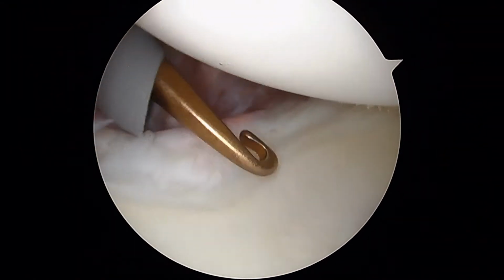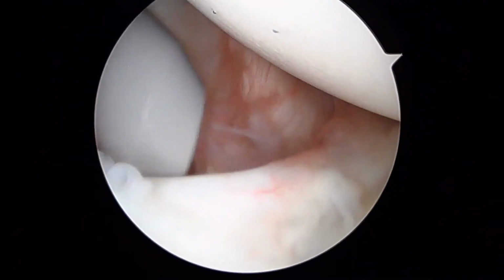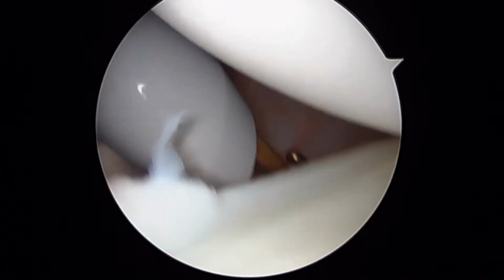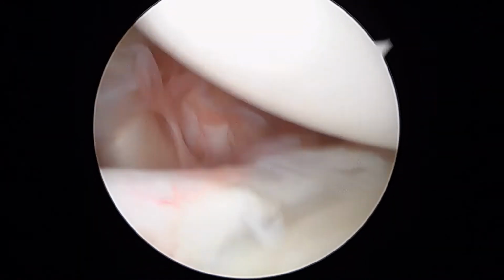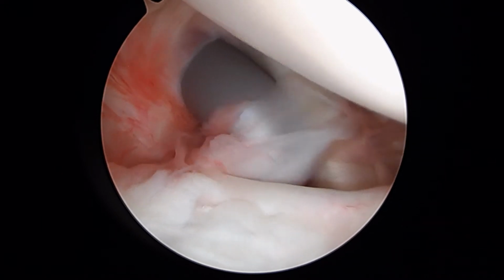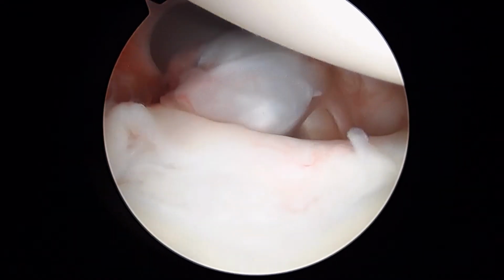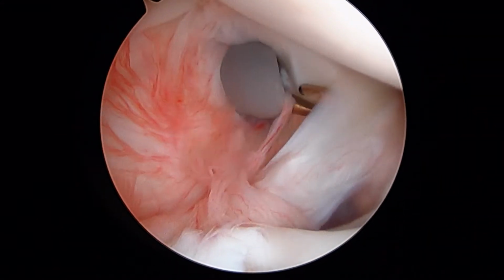And then as we look down the front of the shoulder, the anterior ligaments look just great. Here's the anterior band of the inferior glenohumeral ligament. We're going to rotate the camera. We'll get a good look here. This little wispy thing is all you have of the middle glenohumeral ligament. That's the middle glenohumeral ligament right there. Behind that, right here, is the subscapularis tendon.